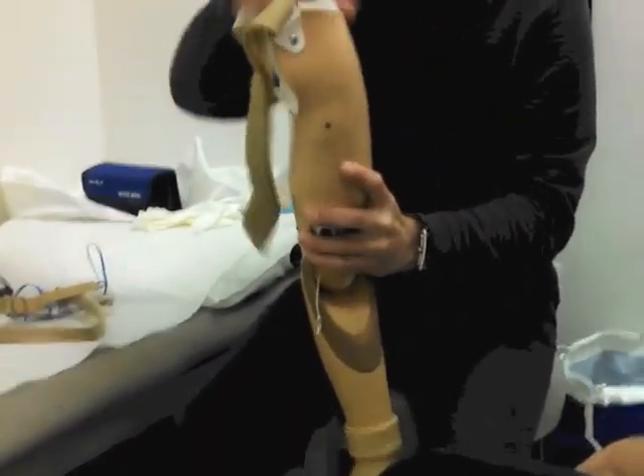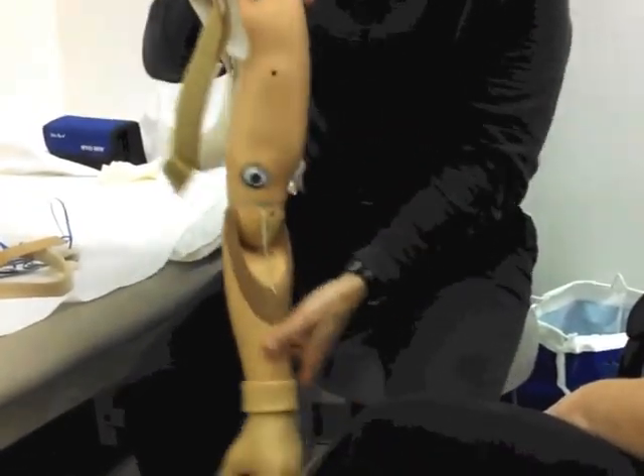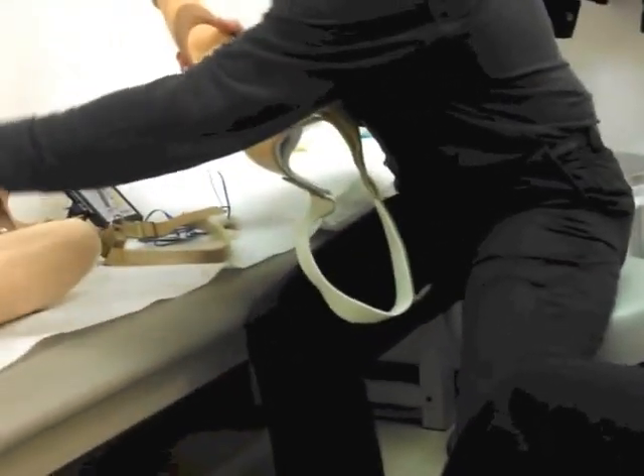Then you would Velcro this to yourself. What it does is it's a lateral pull — it's pulling it to you, keeping this socket, keeping the outside of it against you, the outside of your shoulder or the arm. So this is how it suspends with this prosthesis.